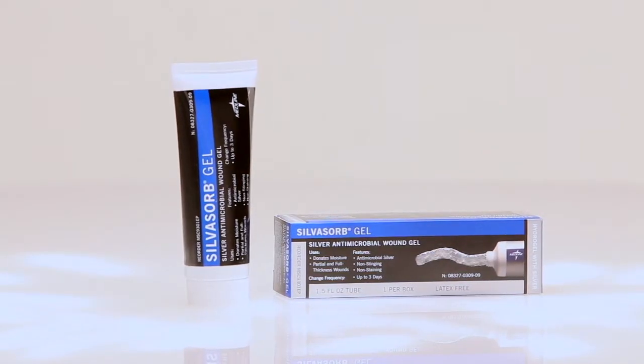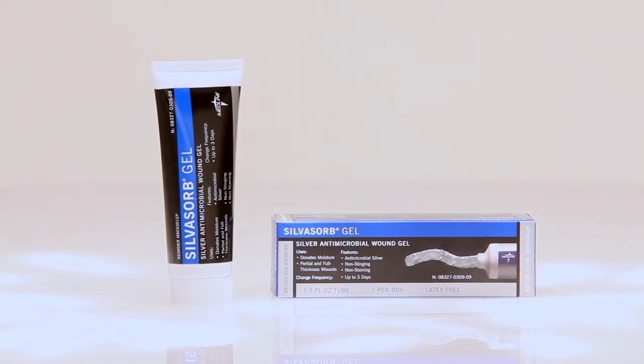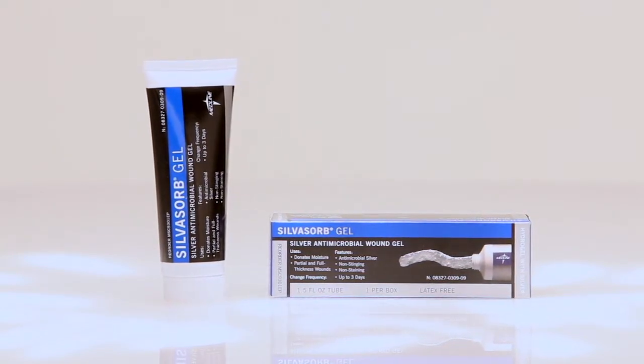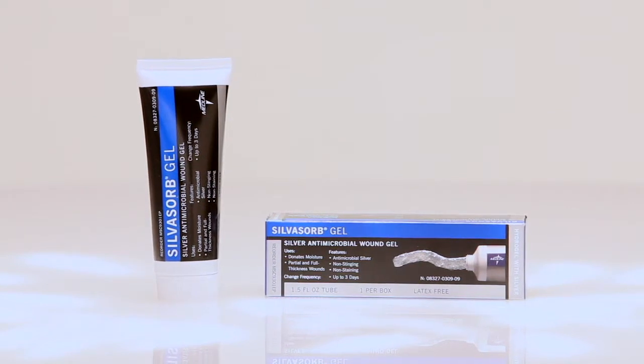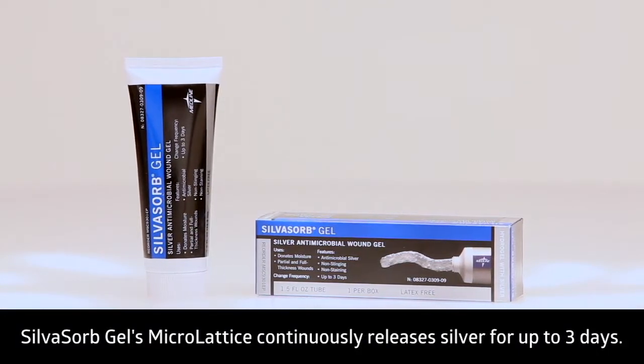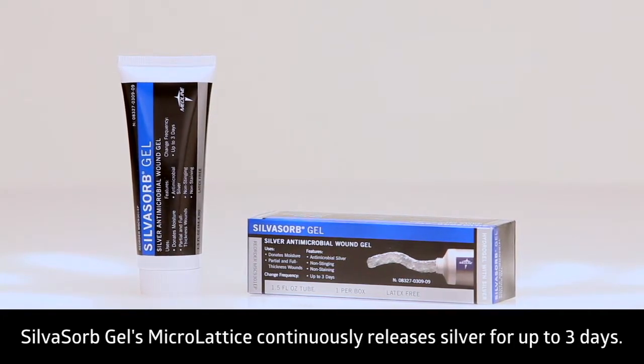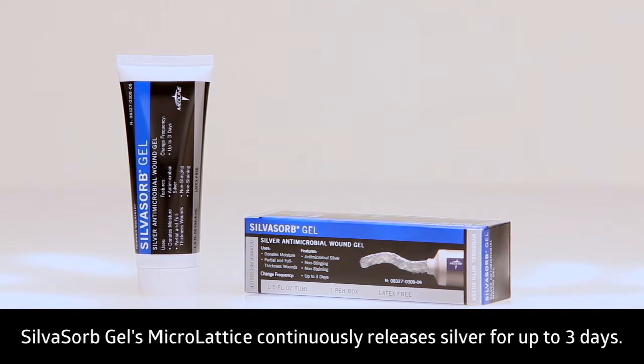Silvasorb Gel combines a hydrogel's ability to maintain a moist wound healing environment with the benefits of bio-burden control. Its unique architecture features micro-lattice particles that suspend ionic silver within its molecular scaffolding, continuously releasing silver for up to three days.